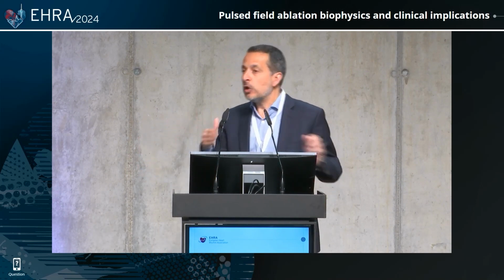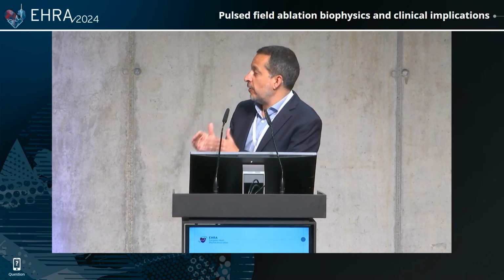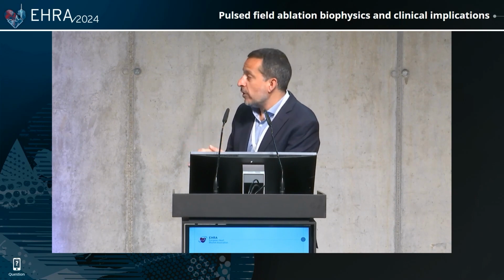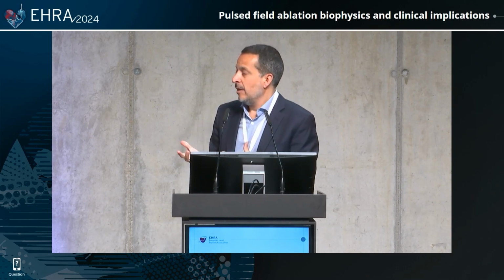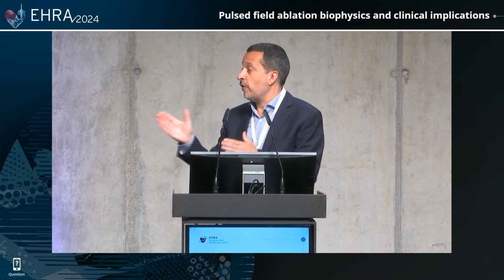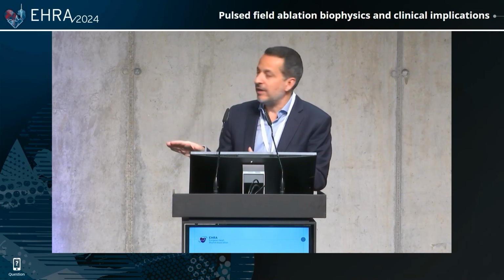We are trying to go around this, trying to find markers of reversibility and irreversibility at the acute phase. But I can tell you, we are working on it, but it's extremely difficult. And we are working with different parameters that we are not used to looking at. But signal disappearing doesn't mean anything. Of course, it's disappearing, because if you don't get signal disappearing acutely, you can forget about that technology, because acutely it has to disappear.